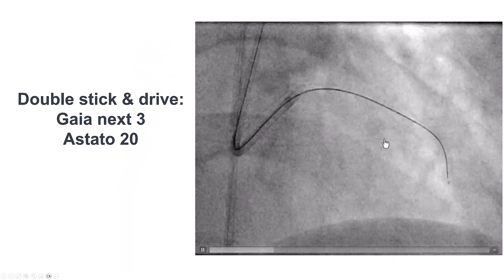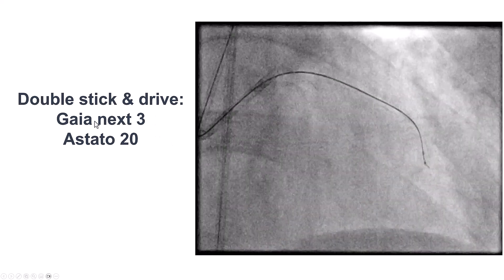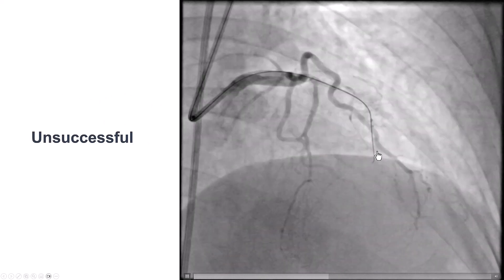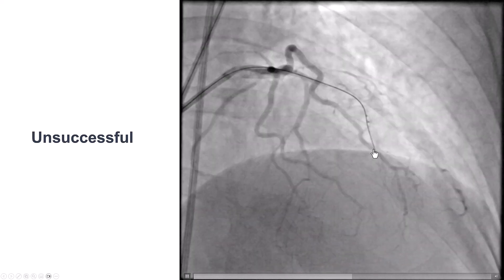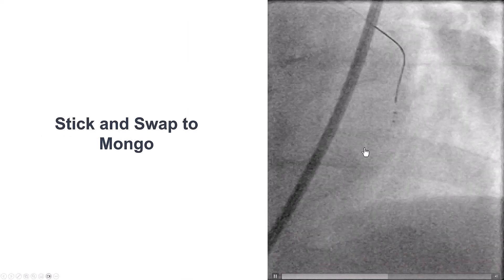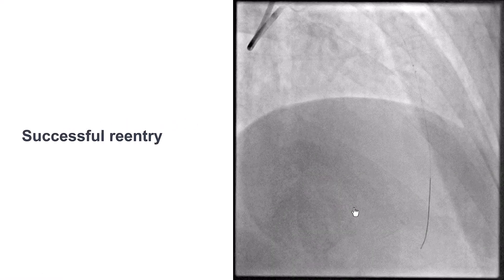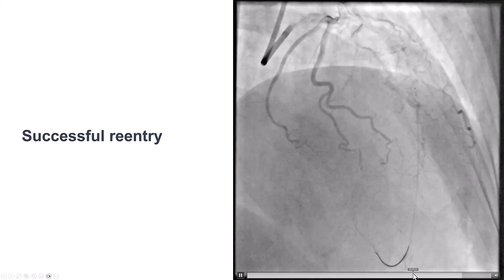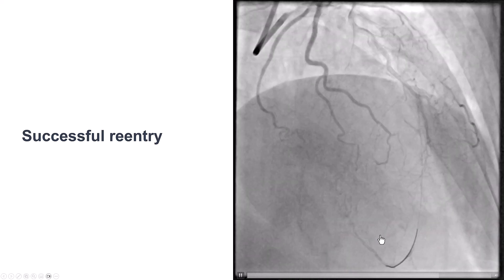As a result, we decided to switch to ADR with the Stingray device. We delivered the Stingray and tried to puncture with a Gaia Next 3 and then a Astato 20, but we were unable to re-enter. We then used the stick-and-swap technique for a Gladius Mongo guidewire, and this time we did successfully re-enter into the distal true lumen. We confirmed the re-entry as the vessel opacified with contrast injection, confirming we were in the true lumen.